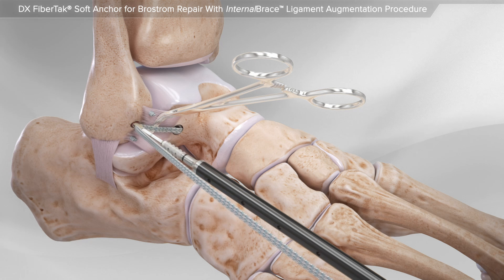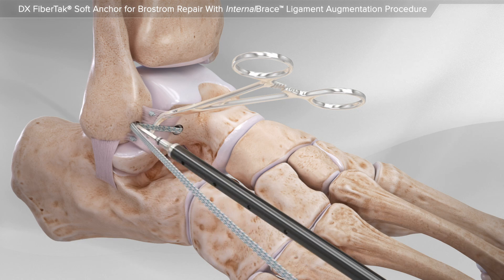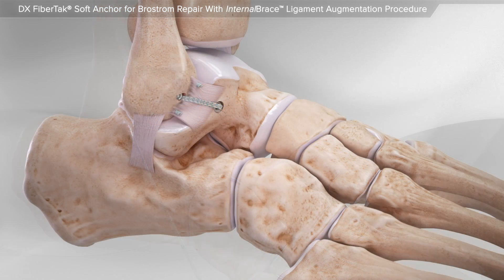Lastly, your surgeon tensions the high-strength suture and secures the anchor in place. This completes the Broström repair with internal brace ligament augmentation procedure.